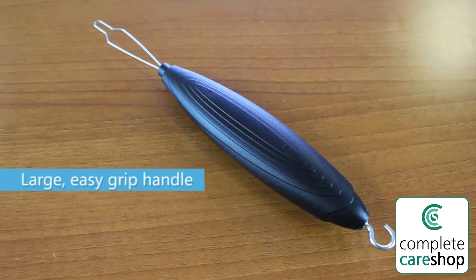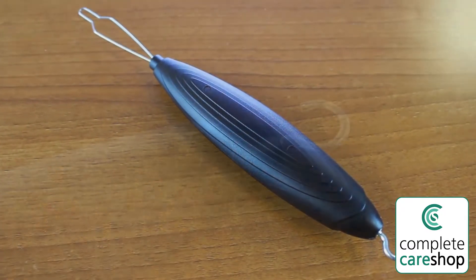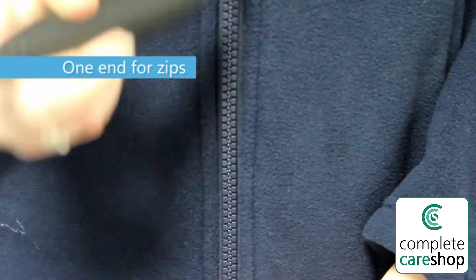This helpful little device is great if you have difficulty manipulating fiddly buttons and zips. To open and fasten zips, simply use the hooked end to attach to the zip and pull up or down.